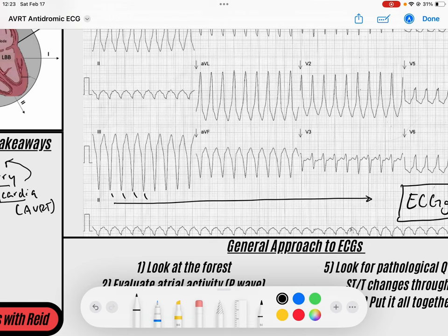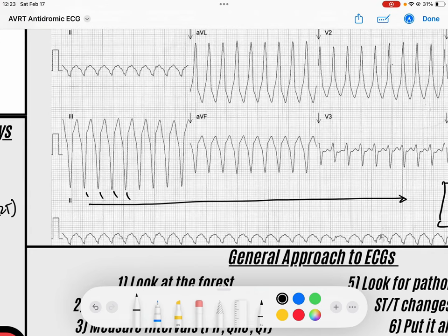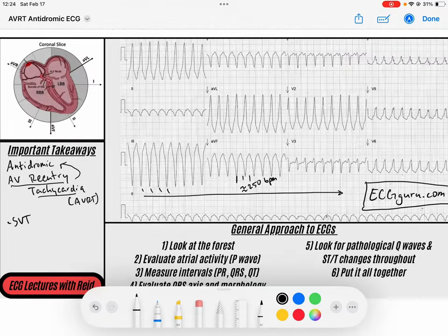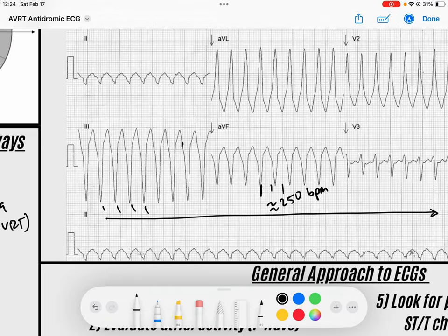The rate here is somewhere, if I find a QRS that lands on a solid line, maybe this one, you can see it's 300, 150. It's very fast approaching 300. I would say maybe 250 or so beats per minute. So this is very fast, regular. And if you notice, it's a wide complex rhythm.